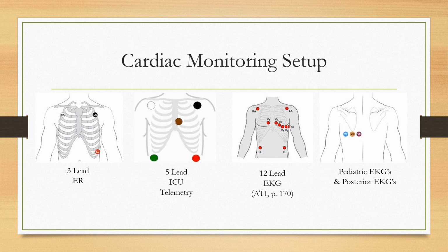We're just looking at different views of the heart, and the general setup is a lead at the right arm, and it can be anywhere on the right arm, the right shoulder, all the way down to the wrist. Left arm, right leg, and the right leg can be from the hip down to the ankle. Left leg, and finally the ones that are going right across your chest, V1 to V6. So just get the general idea of how an ECG is set up.